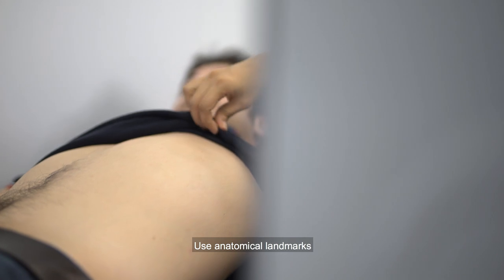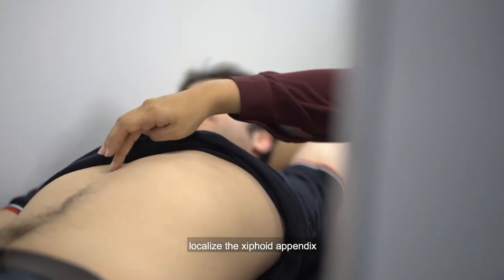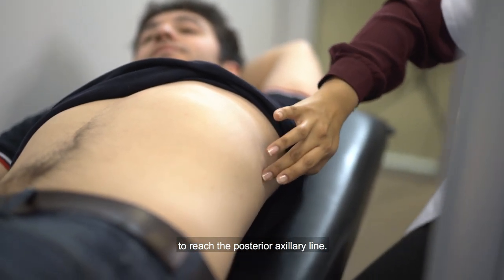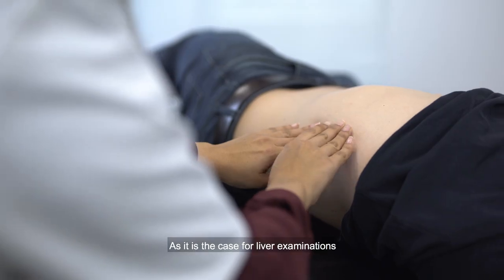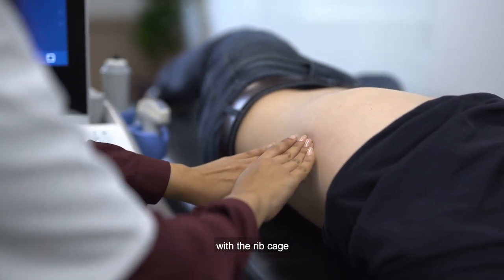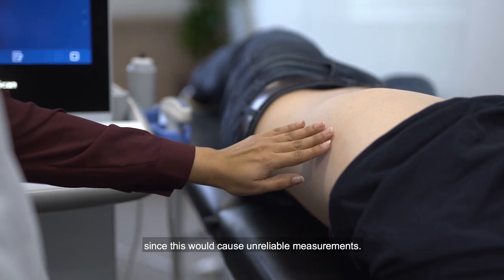Use anatomical landmarks to find the spleen. Localize the xiphoid appendix just below the sternum and then draw a line to reach the posterior axillary line. As it is the case for liver examinations, make sure to avoid any contact with the rib cage, since this would cause unreliable measurements.